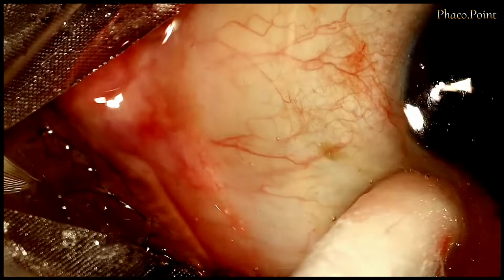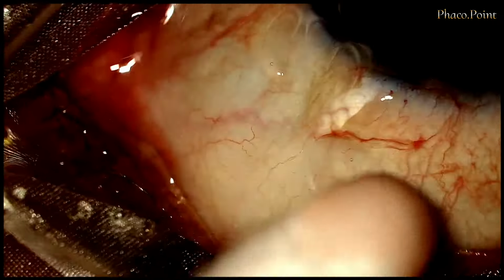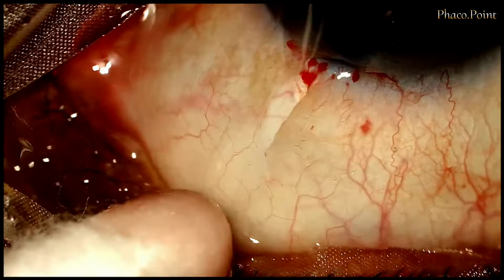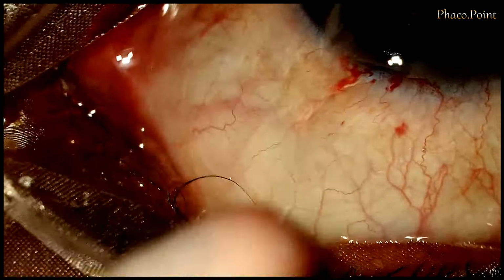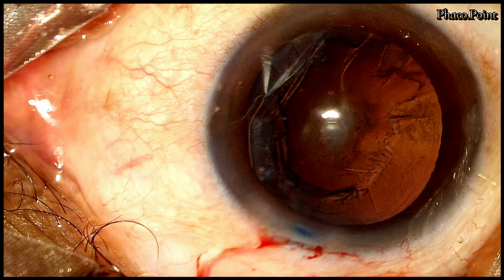Depending on the extent of the conjunctival ballooning, it may take a little more time, and often it may take more than one radial cut in order to decompress this conjunctival ballooning. In this case, one single radial cut was adequate.